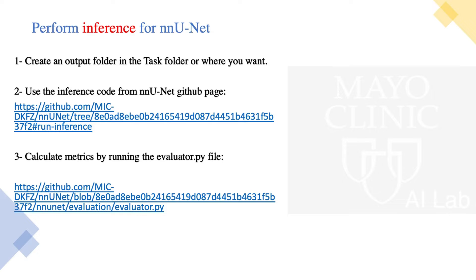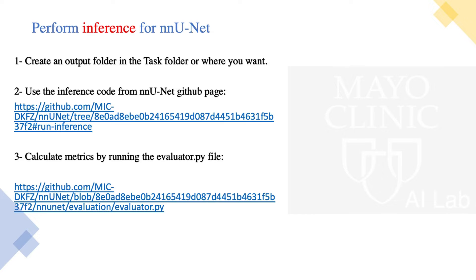Then we just need to easily use the inference command that is on any nnU-Net GitHub page. So there are multiple options based on which model do you want to use, if you're going to use a pre-trained model, or you want to do an ensemble. But here I'll show you one simple example of how to use this command, but rest would be easy if you just get the concept here.